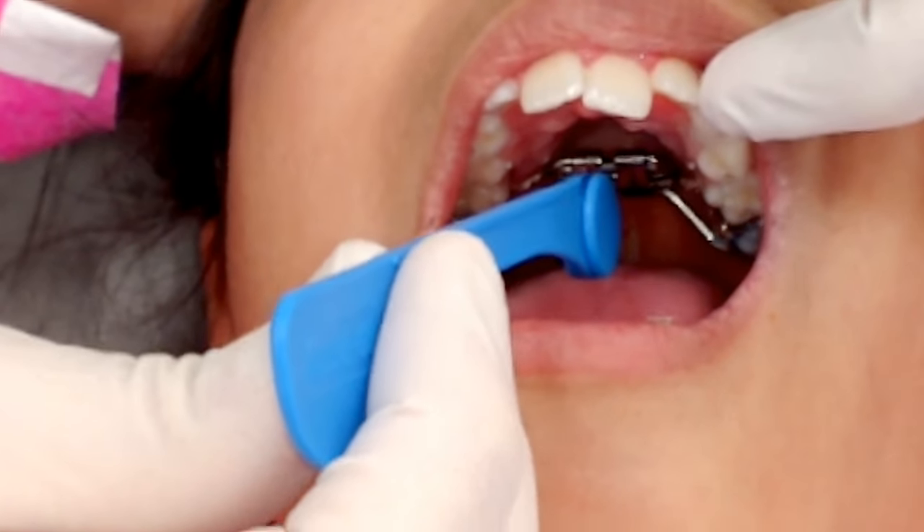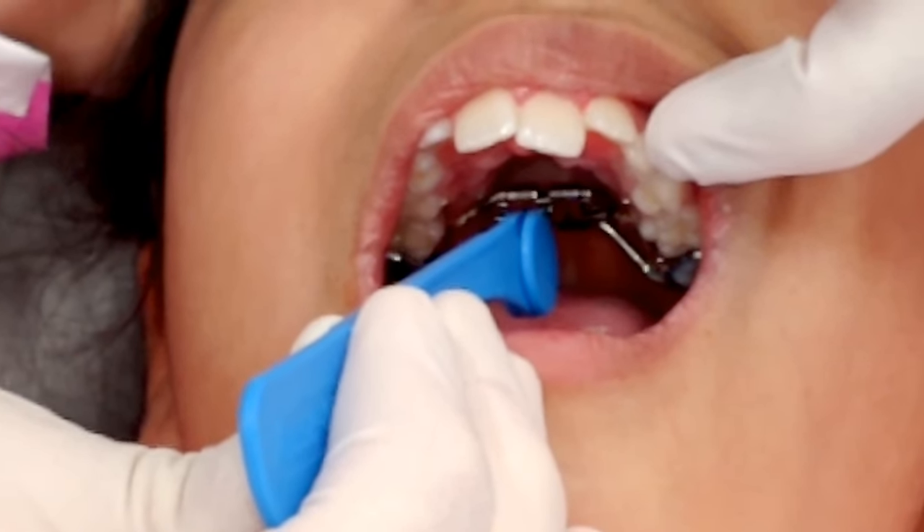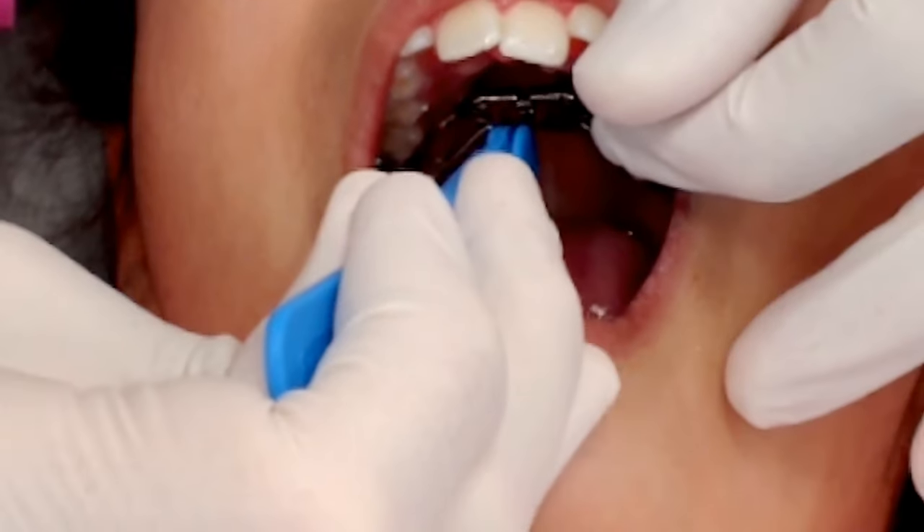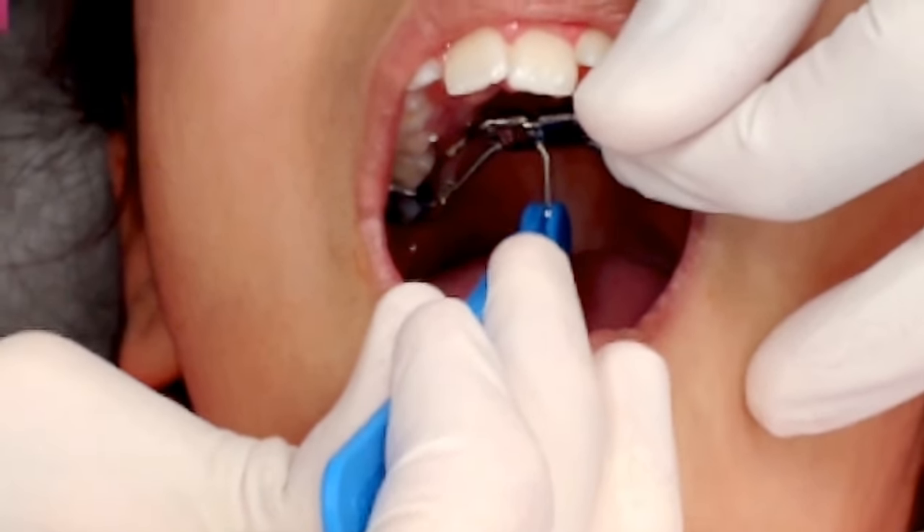Once we have the key in the hole, we're going to push towards the back of the patient's throat. Open up big. And we're going to push — it's going to be fairly firm — and we're going to push until we can't push anymore.